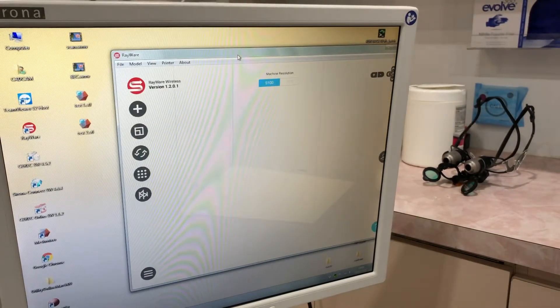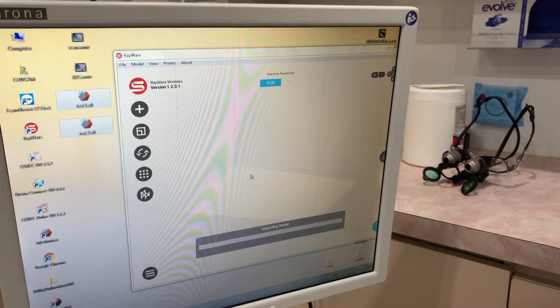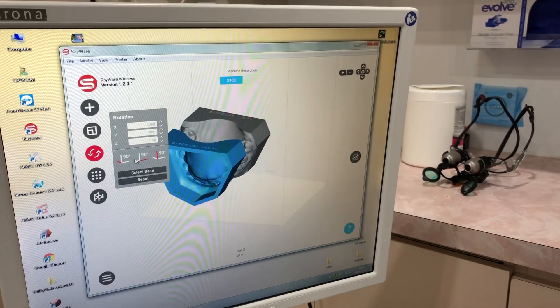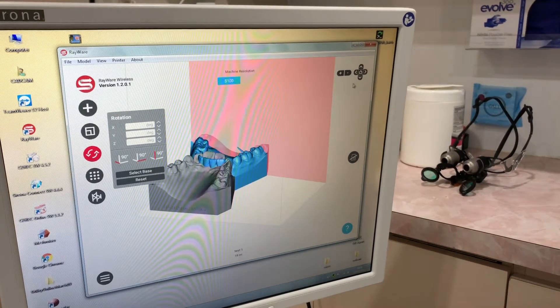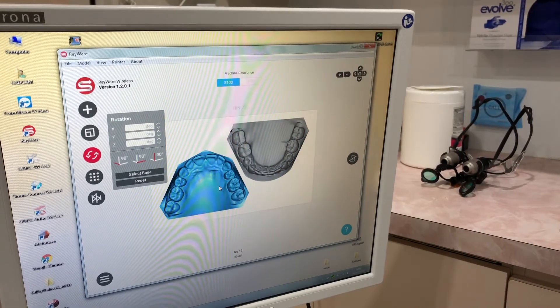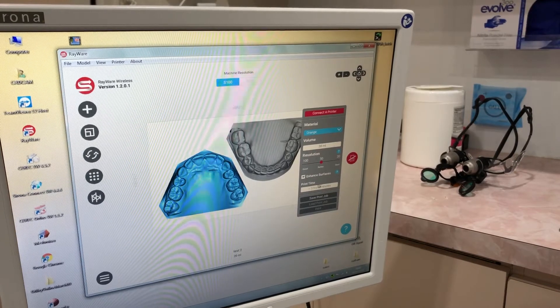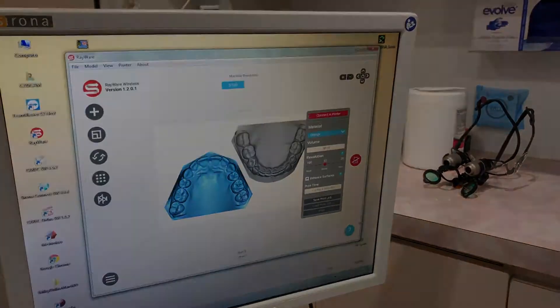All I do now is import both of those models into Rayware, reorient them and then print them. It uses about 50ml of resin once you've accounted for wastage, and takes just over 3 hours to print a set of base study models.